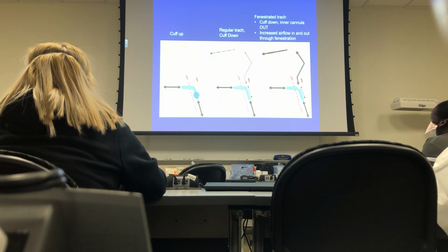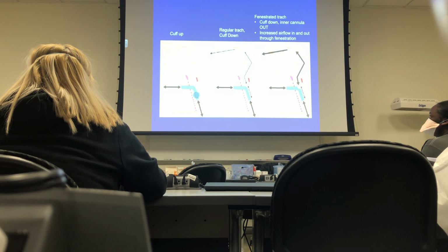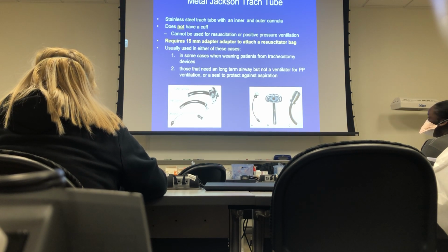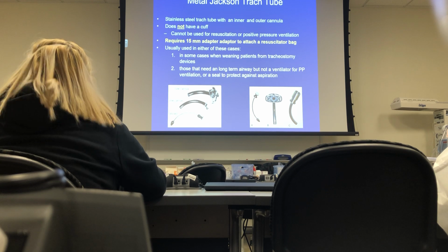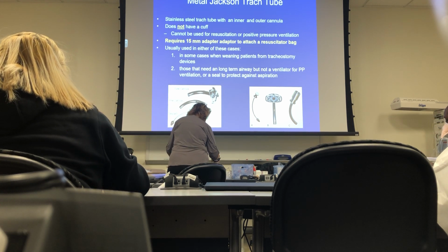Does it make sense to everybody? I know you guys are sitting here listening to me, but does it make sense? Yeah, okay, all right. So the fenestrated trach, if I say what's the indication, it's facilitating weaning so that during the day the patient can be off the vent, they can talk, they can use their upper airway, okay? All right, metal trachs, guys, these have a tendency to be permanent trachs. Want to put all your fenestrated trachs back together and your regular trachs back together?